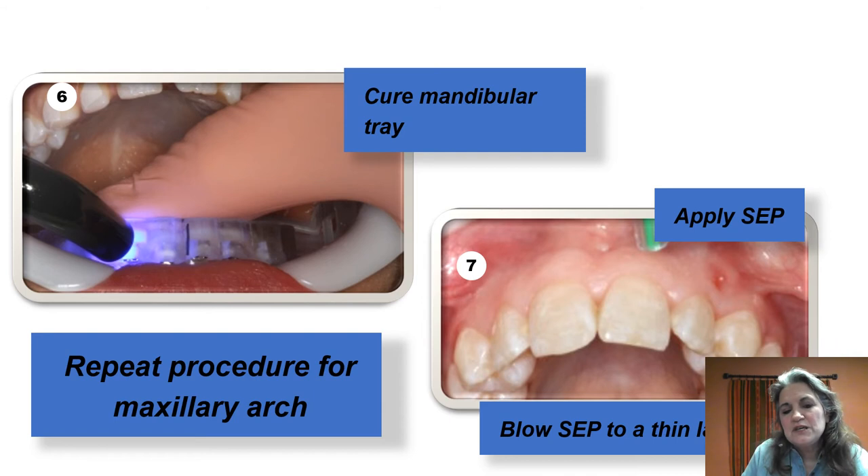You can see part of the bracket from underneath because with our tray design we don't completely cover the bracket — you can see the gingival wing. I recommend tack curing from underneath and then staff can cure interproximally. Once the lower tray is completed, you can either remove the tray or often my staff will just leave it there, because it helps hold the tongue back and keeps saliva out of the way.